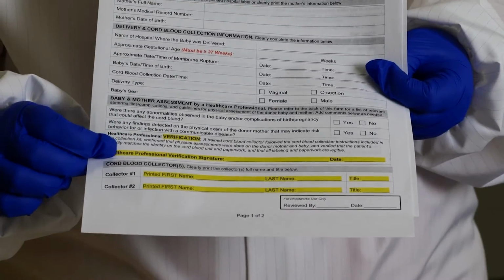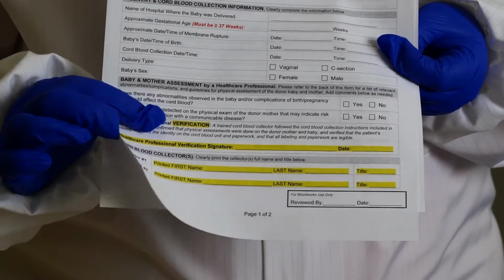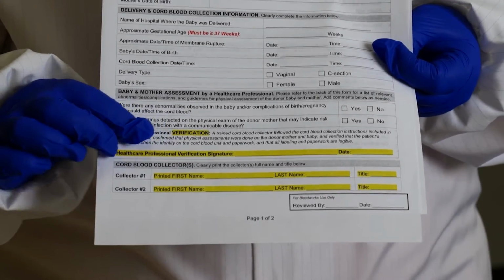A verification signature must be included for all collections. This can be signed by one of the cord blood collectors or anybody involved with the collection.